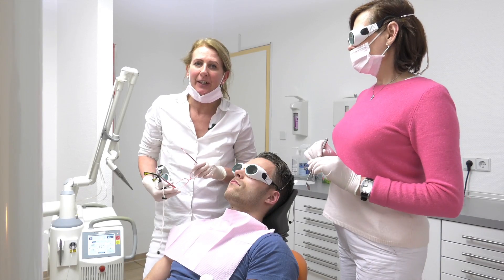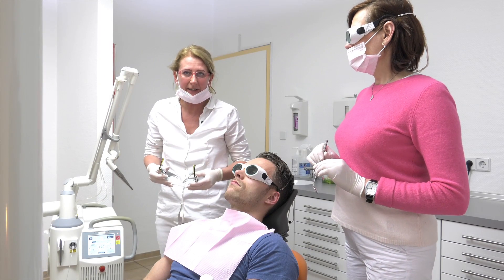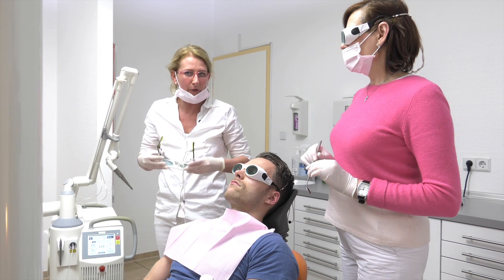Okay, here's the picture. You can see it's a posterior tooth and you can see the disease — you can see the caries. And I show you how to get rid of the caries by using the Erbium YAG laser.